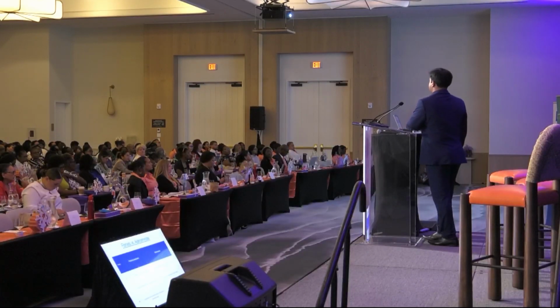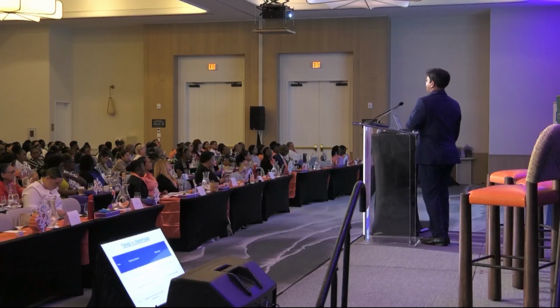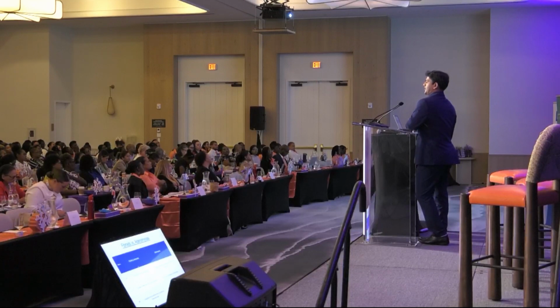Next common thing is fibroids versus adenomyosis. As you know, a fibroid is a benign lesion which consists of fibrous tissue and smooth muscle fibers, whereas adenomyosis is endometrial tissue which is extending into the myometrium. So fibroids are usually well-defined. They appear dark because of the smooth muscles, whereas adenomyosis is not discrete, it is diffuse. It usually involves the junctional zone and causes thickening of this junctional zone. So anything more than 12 mm of increase in the junctional zone is classical for adenomyosis.